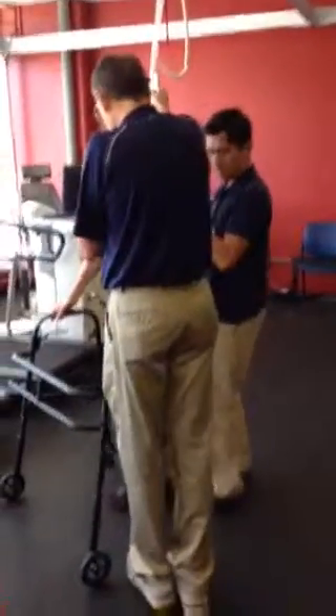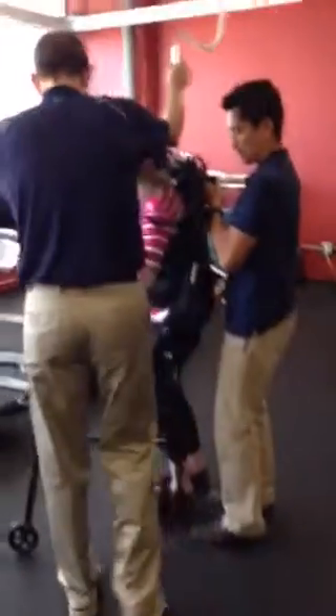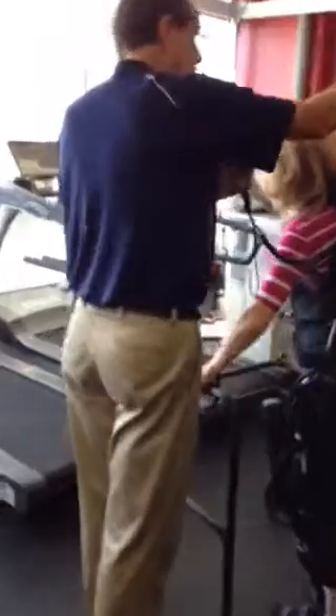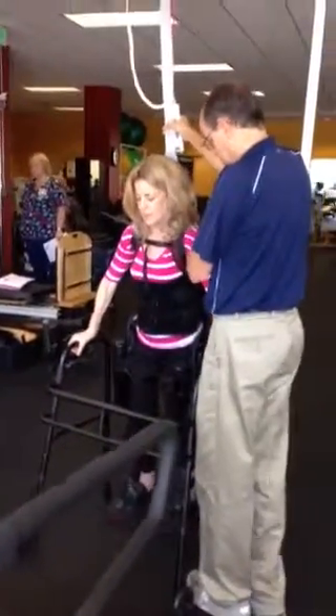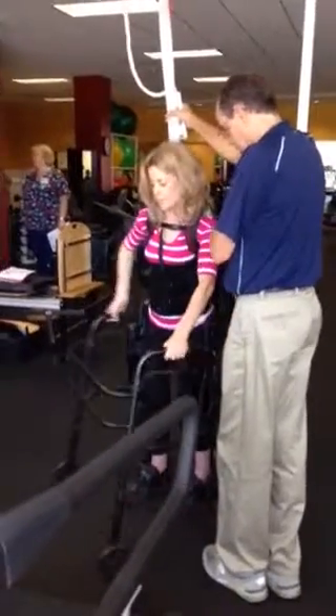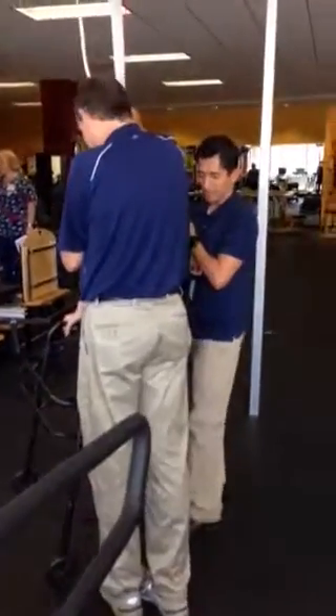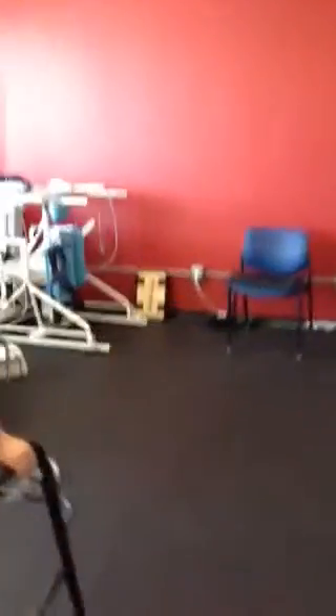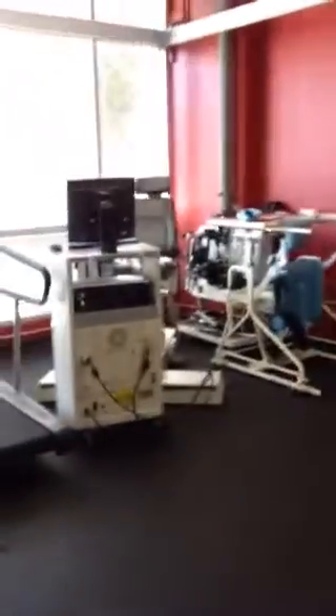Dip. Walker. Not too far. One, two, three. We don't have to lift too high — you can just let me pivot. So you're going to turn your body that way to the right. One, two, three. Good. Walker. We'll do it a little by the way. One, two, three. Walker. And a little bit more so we can line up our feet. One, two, three. Try to push down longer when we're tipping.